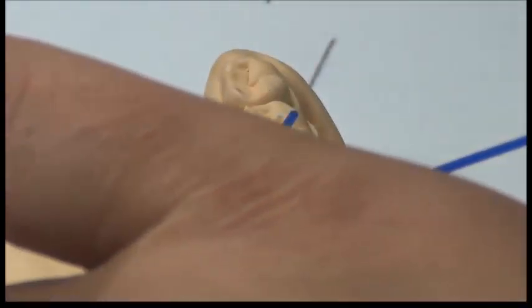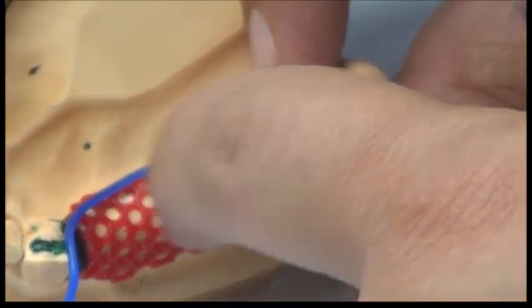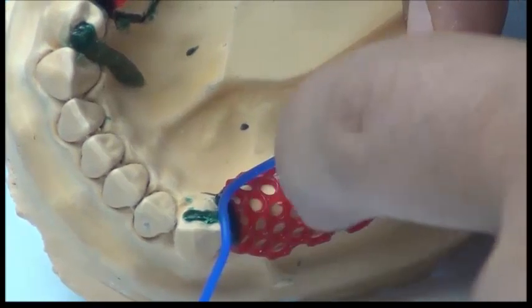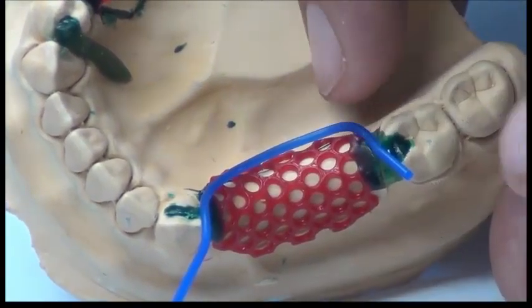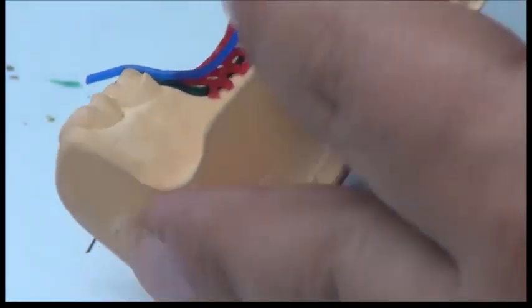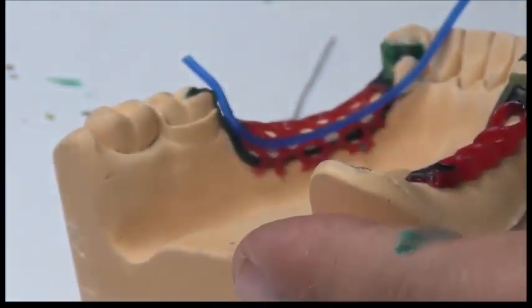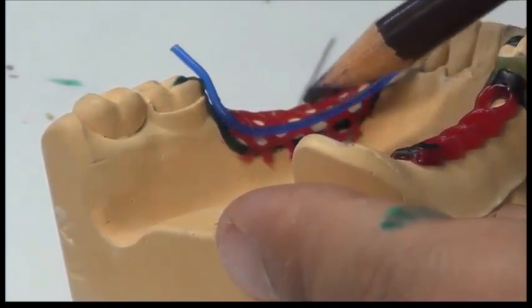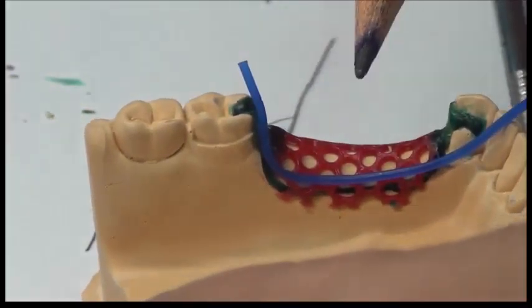Okay, once more, for the bounded saddle area, I'm going to place the wax running down from the guide plate, the lingual surface of the guide plate, okay? Running down from the lingual surface of the guide plate over the mesh area. Then, with an angle, I'm going back parallel to the ridge. But if I'm looking lingually, I'm away from the internal finish line, okay? If I'm looking at it lingually, this is the internal finish line and this is my external finish line. So they are separate from each other, but at the same time I'm leaving enough width for the teeth to be added.